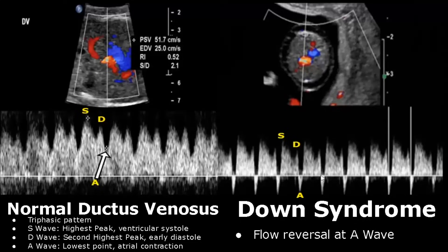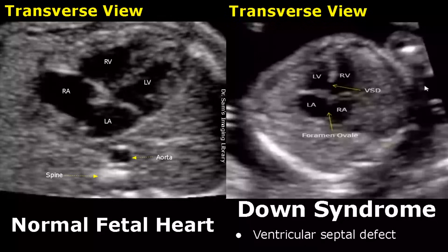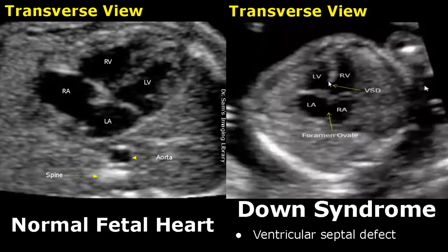A ventricular septal defect is a discontinuity in the interventricular septum — this is the defect. It is also a soft marker for Down syndrome.